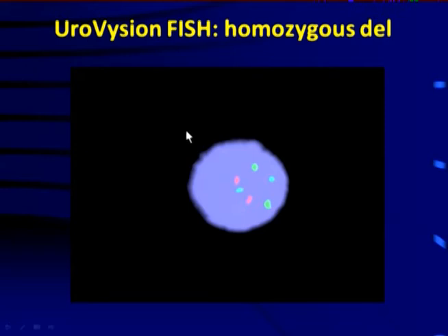In the literature, in some articles, you'll see a double homozygous deletion, which is really a redundant term, but we see that in the literature. Double deletion or homozygous deletion or double homozygous deletion. And both gold signals are deleted. In the last example, we saw 1 gold signal deleted. If we see 1 gold signal deleted, it doesn't mean anything. Like the previous example, it may be that 1 gold signal is on top of the other, and there really are 2. We're only seeing 1. They both have to be deleted for the cell to be considered abnormal.